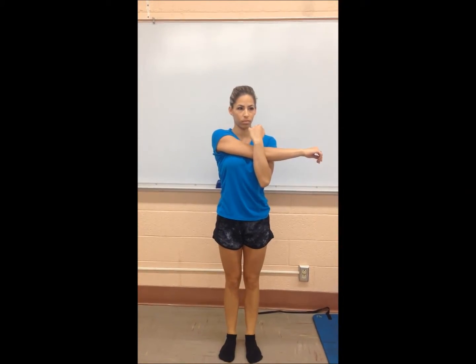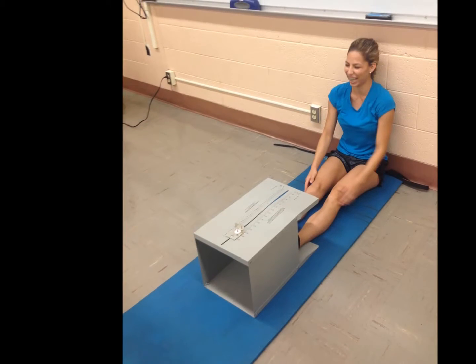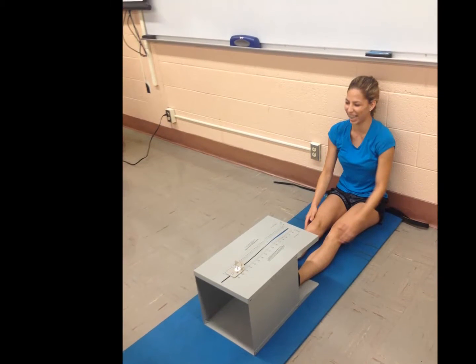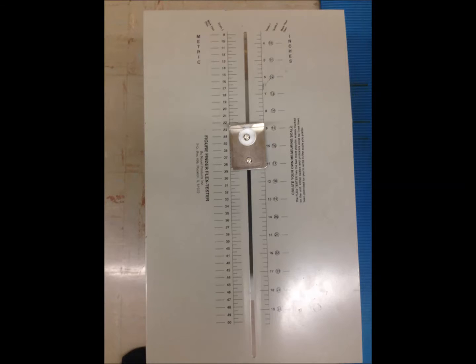The first test that will be assessed is the Canadian Trunk Forward Flexion Test, also known as the Sit and Reach Test. This will test the hamstring's flexibility. Have the subject sit with back against the wall and take off their shoes. Once their shoes are off, have them place the feet flat against the sit and reach box at the 26 centimeter mark. However, this box is 3 centimeters off because the 0 point is set at 23 centimeters.